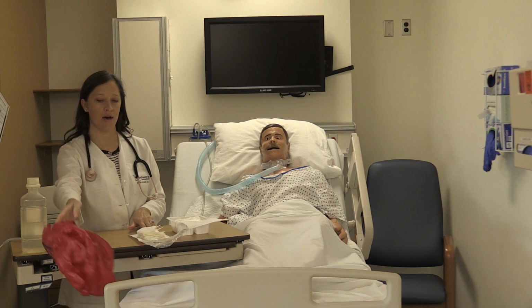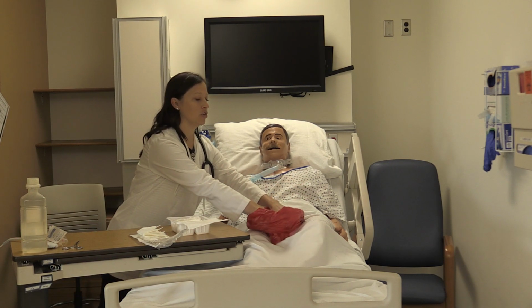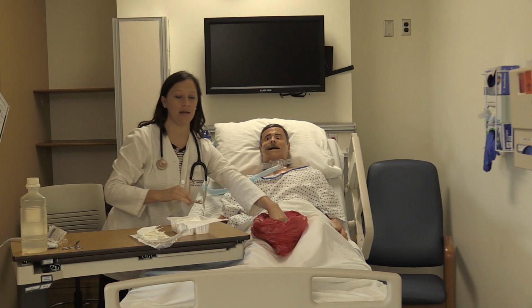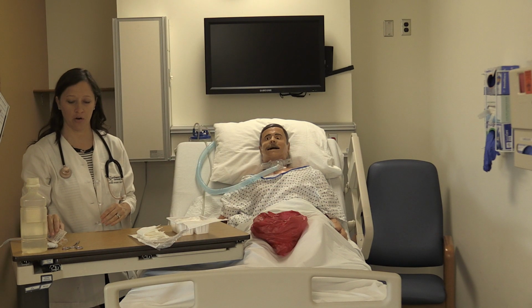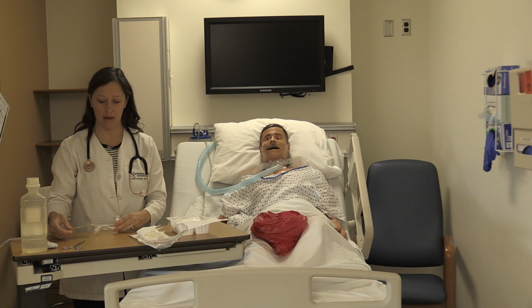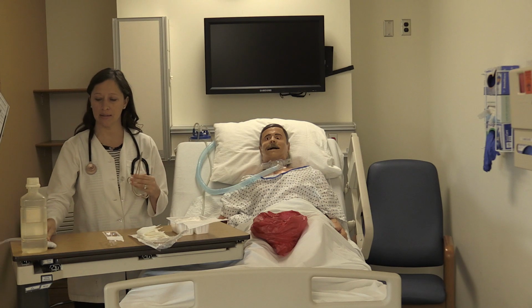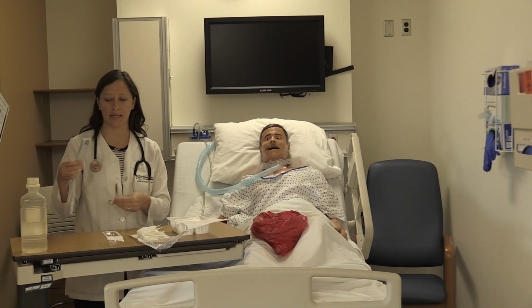You also want to have a biohazard bag within reach. And again, your suction needs to be at about 80 to 120 millimeters of mercury. Then you're going to open up your new inner cannula and have that ready. And then you're also going to need hemostats and a new trach tie.